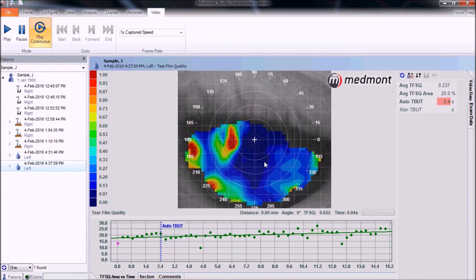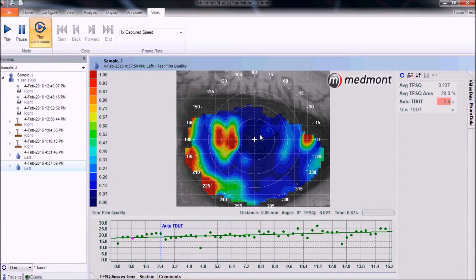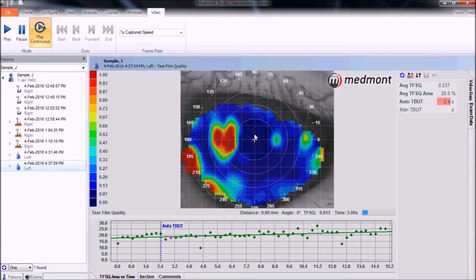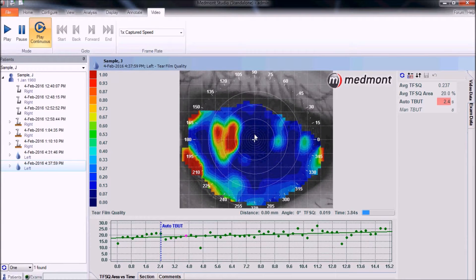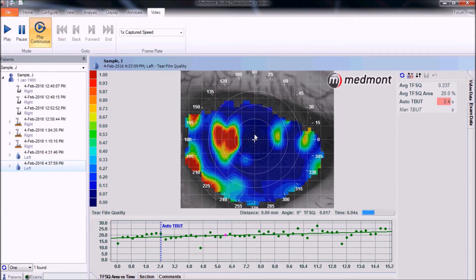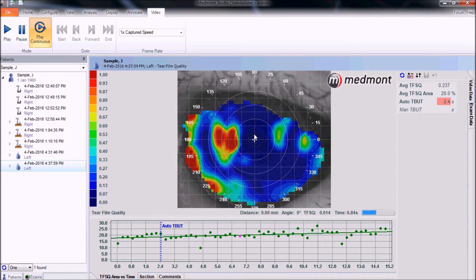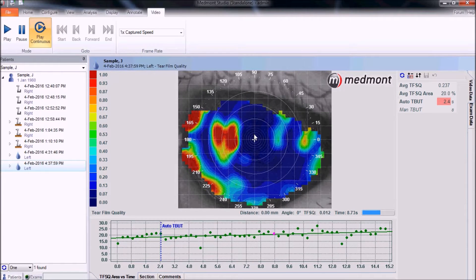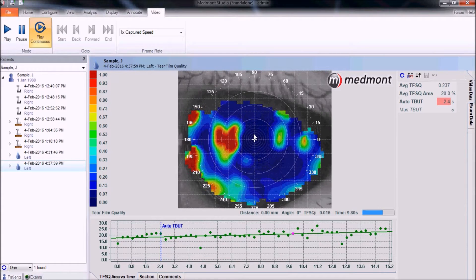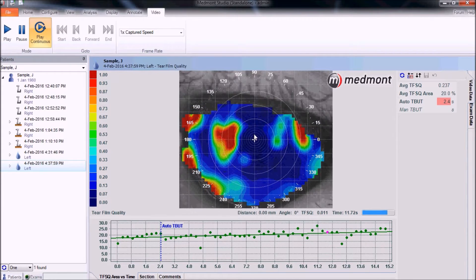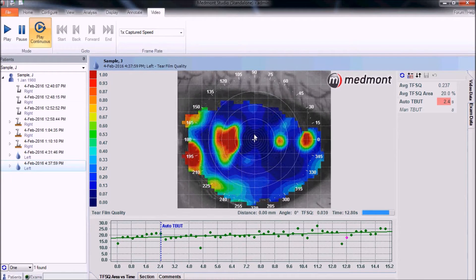We can see that dark blue areas indicate where the tear film is very smooth and even. Areas showing hotter colors — the reds and yellows — are areas where the tear film is in breakup or very dry.